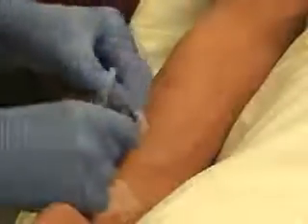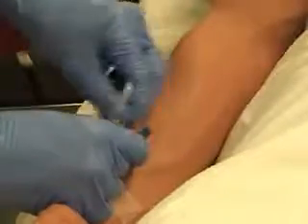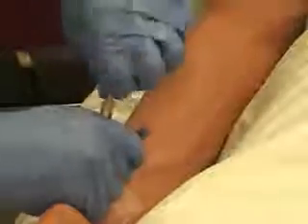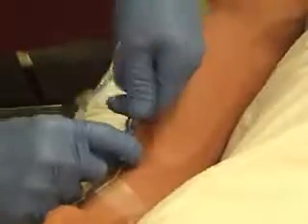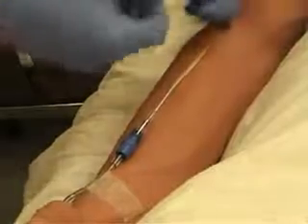When it is time to attach the IV fluid, wipe the luer lock with an alcohol prep pad. Unscrew the cap from the IV tubing, being careful not to contaminate the sterile tip. Screw the IV tubing to the luer lock. Make sure the connection is secure. Now tape the tubing to the patient's arm to prevent it from getting tangled.